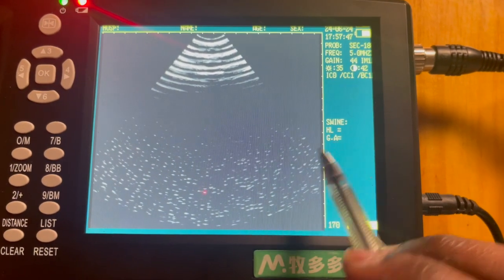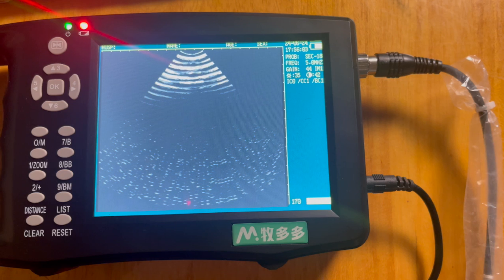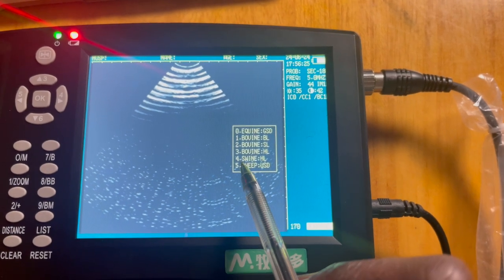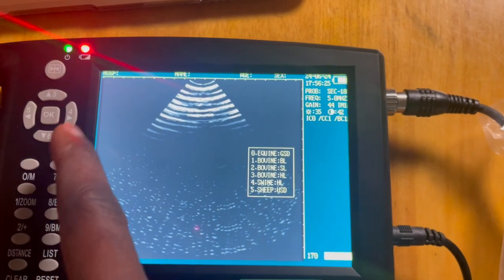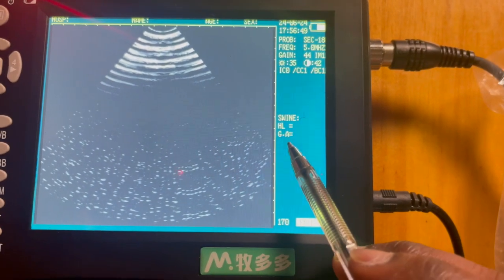The device also provides the gestation period for your animals — cow, cattle, sheep, pigs, cats — showing how long it will take for your animal to give birth or farrow. If your farm animal is already pregnant, it will automatically display the relevant gestation period behind the GA sign. To check the gestation period, select the frozen state by pressing the freeze button, then press the list. For pigs, we select swine, and using the probe on the abdominal wall, the gestation period data will automatically be shown behind the GA indicator.